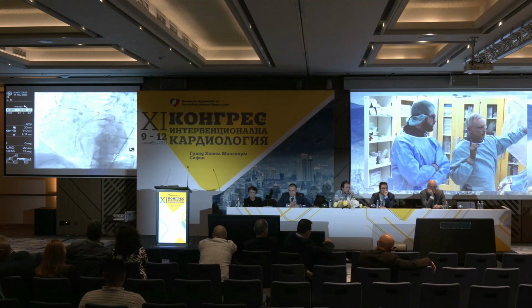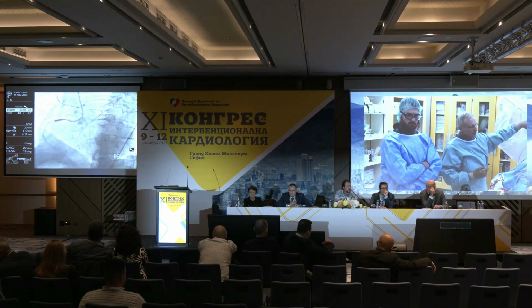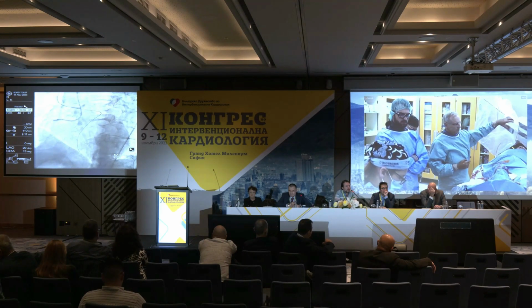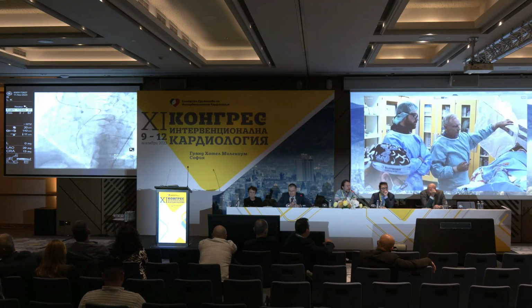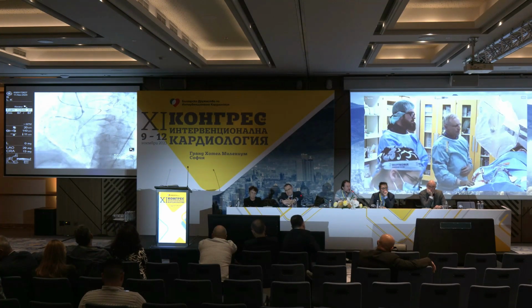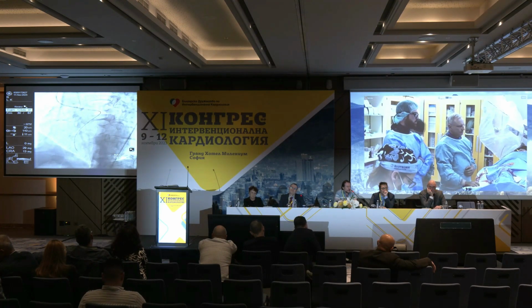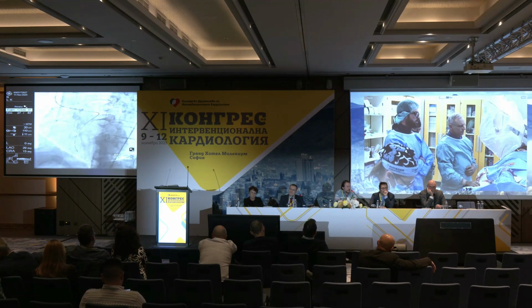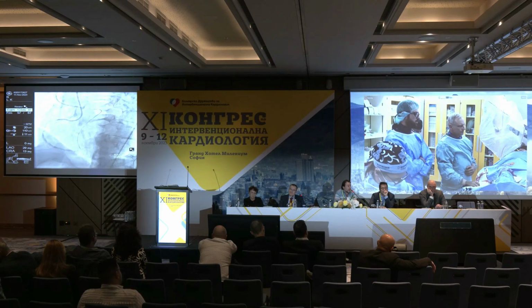I don't hear you well, sorry. Yeah, it's still according to the book, so you are still inside the algorithm. When we do CTOs, we want to be reproducible, you know. So from a teaching point of view, yes, and this is totally in the algorithm. There are just ways of skimming the cat, and you have done a different thing from within the algorithm.